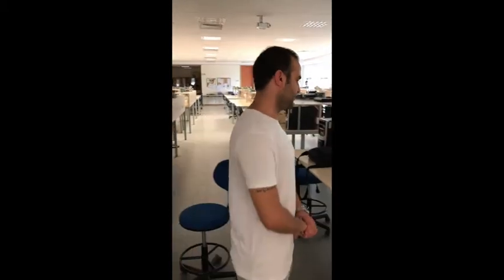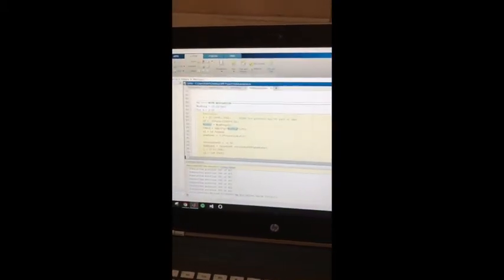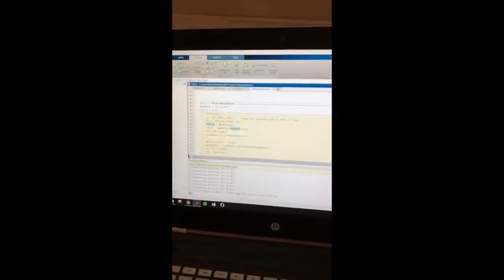Finally, I am modulating the RF pulse that I initiated in the beginning. By modulating the RF signal, I expect that there will be a shift in the slice profile, just as with adding an offset. So for this, I first ran the code without any modulation, as I did before. I find normal values. Then I added a variable with a pure exponential. This is what I modulate the RF signal with.